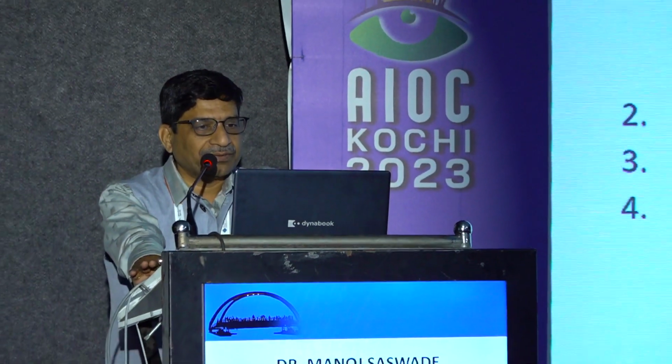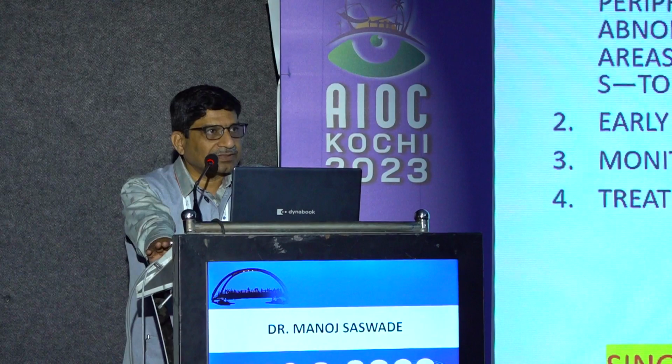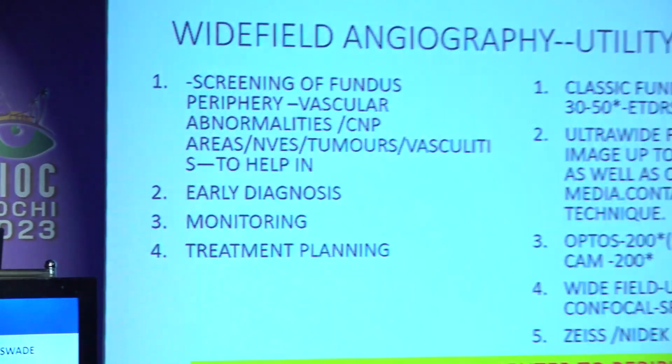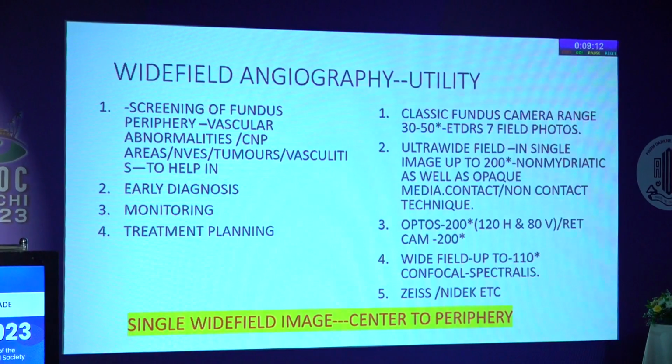because you know now the diagnosis. The classic fundus camera, as already discussed, gives you a view of 30 to 50 degrees, the ETDRS fields, but we are using this Heidelberg Spectralis machine, which gives 110 degrees, and if you tilt it, it can go up to the periphery.